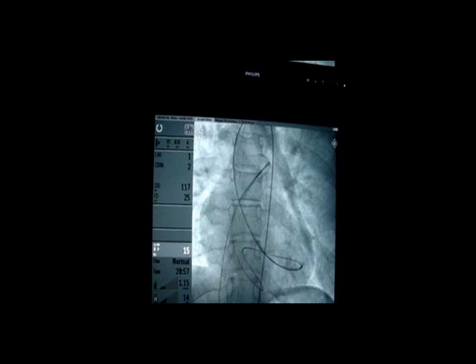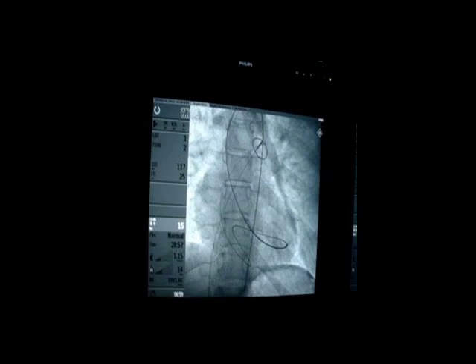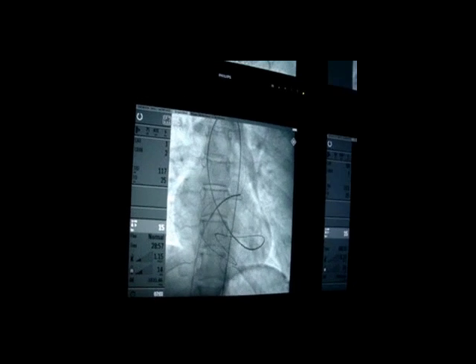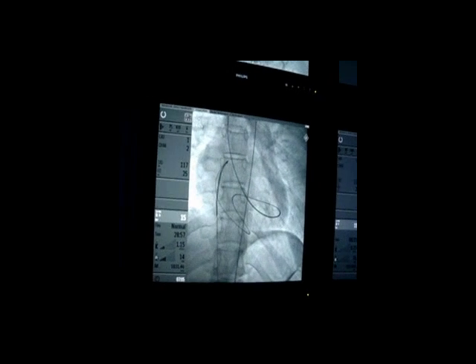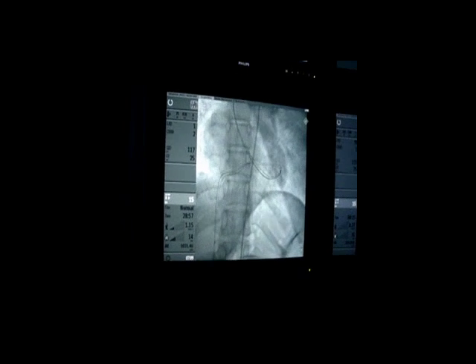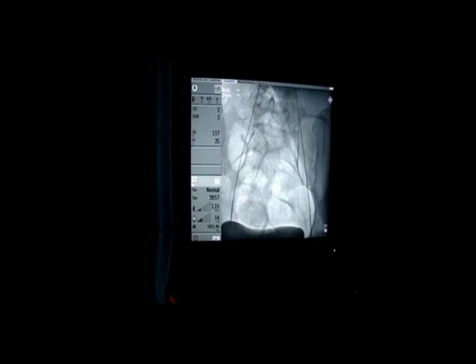The wire from the left side was snared and pulled. It's snared and now pulled. As you can see, we pulled it all the way down and then it was exteriorized.